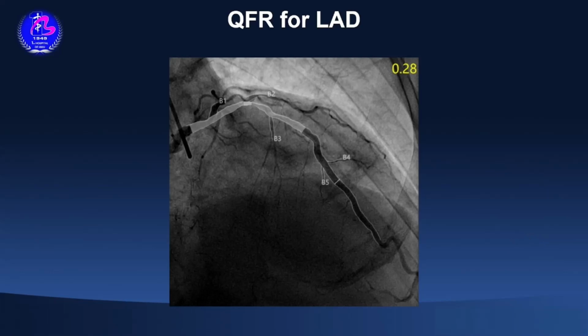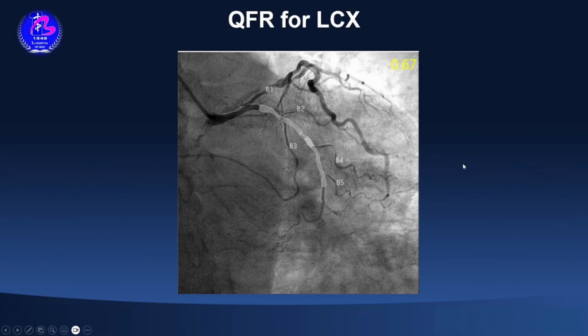Due to the epidemic, the patient's complete revascularization was delayed after his discharge. Before the operation, we conducted a QFR examination on the patient. The QFR of the LAD was 0.28. Next. The QFR of the LCX was 0.67.